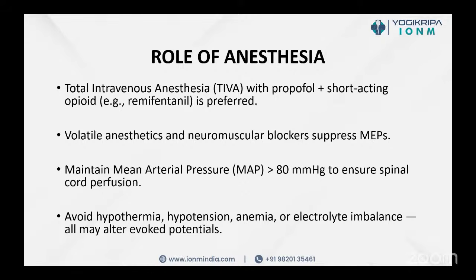Another thing important for IONM is to have the signals properly. Hypothermia, hypotension, anemia, electrolyte imbalance, and all other things also alter our evoked potentials. So anesthetist-wise, we need real cooperation. And if the signals drop, we have to first see the anesthesia side also before informing the surgeon.